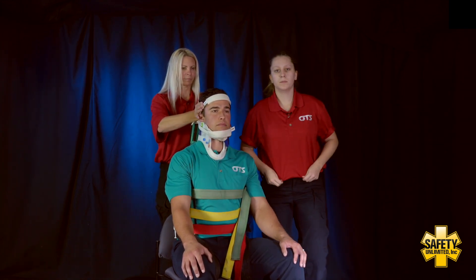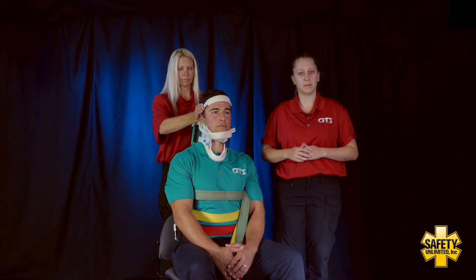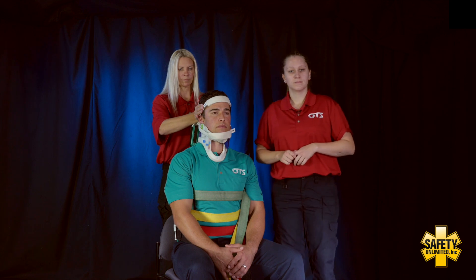From here we're going to go ahead and move him to a long backboard. I'm going to undo the leg straps, and at that point I will reassess CSM in all extremities. Is there anything else you'd like to add? No. Okay, let's go ahead and move him.